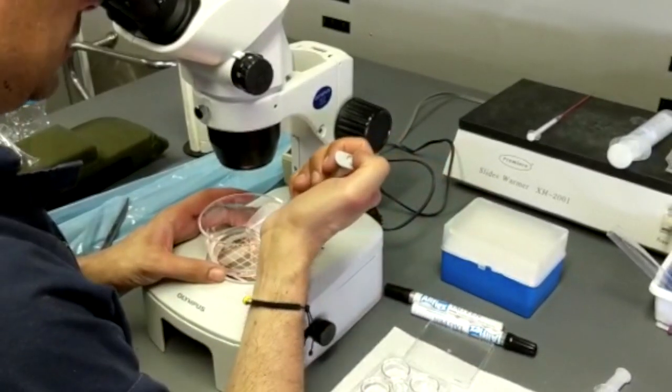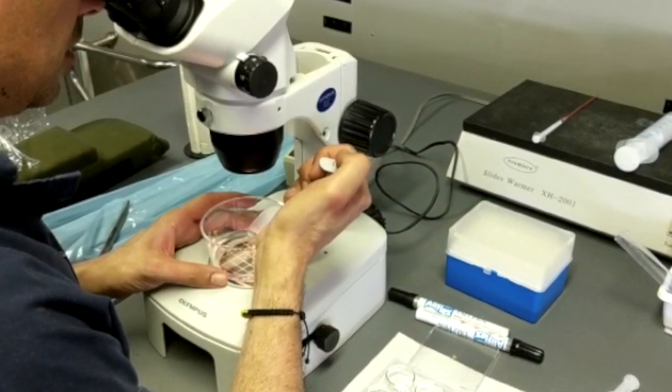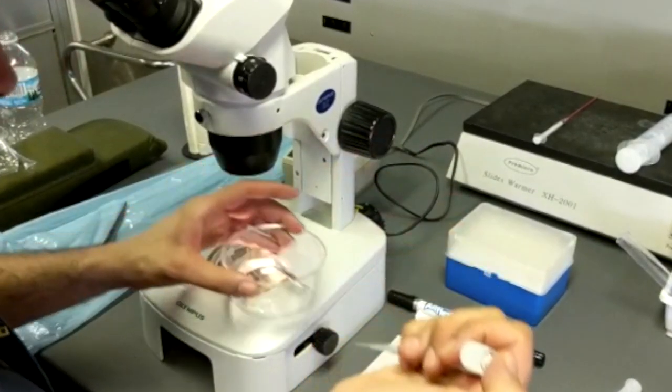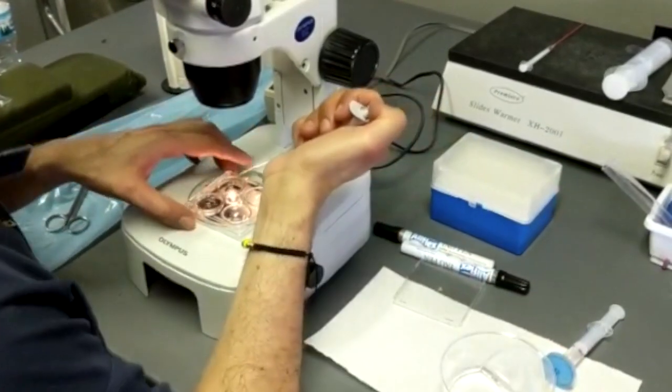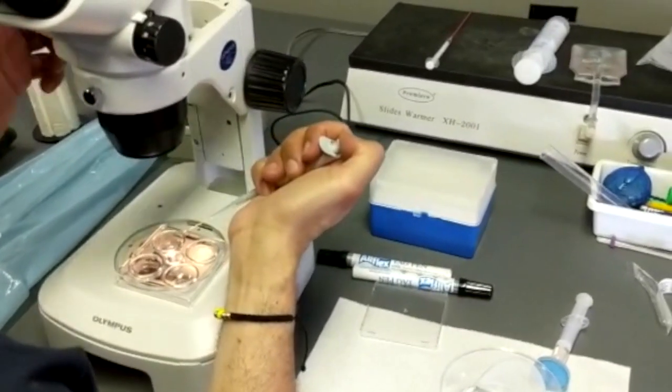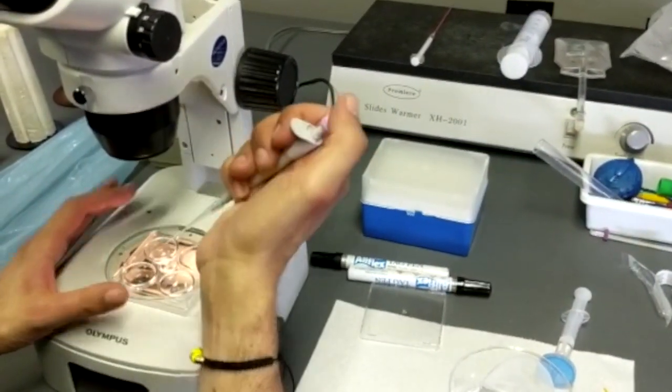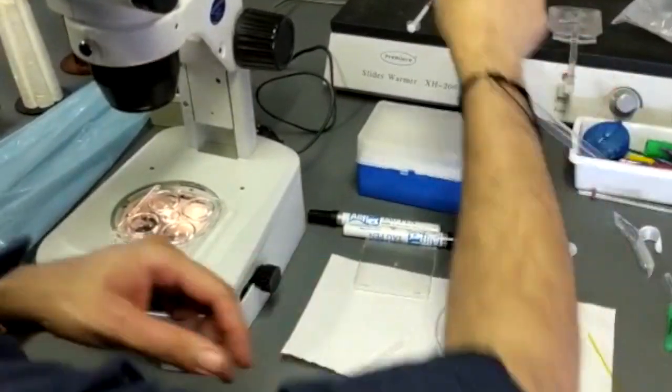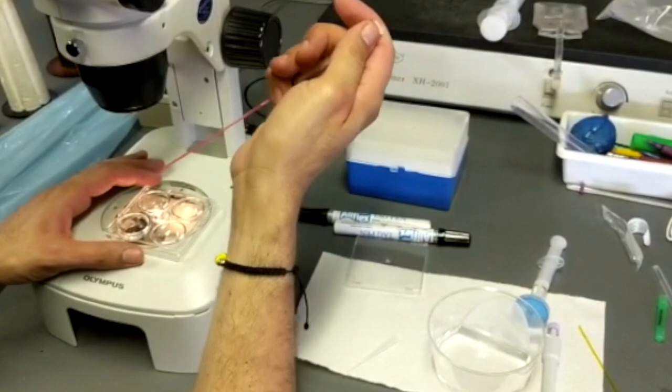Once the embryo has been found, place it in holding media and I load it on a straw ready to transfer.